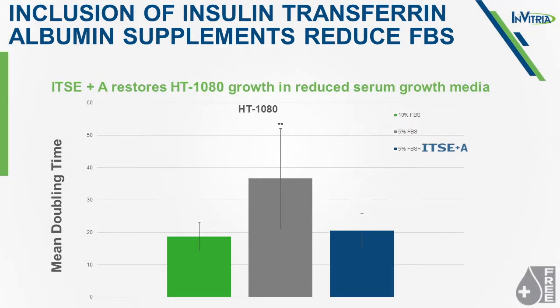Okay. Here's another example, but instead of suspension culture, this is an adherent cell type. HT1080 is a fibrosarcoma cell line that's traditionally used for cancer research. And HT1080 cells are usually cultured in EMEM. Here the full growth media is EMEM with 2 millimolar glutamine and 10% FBS.